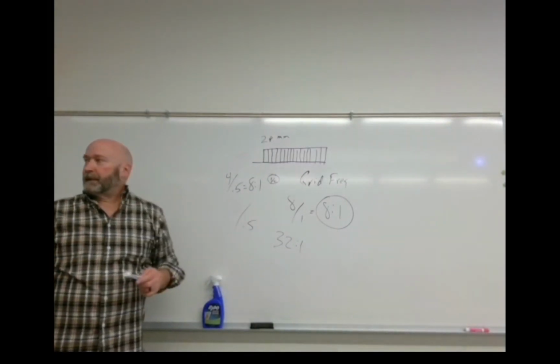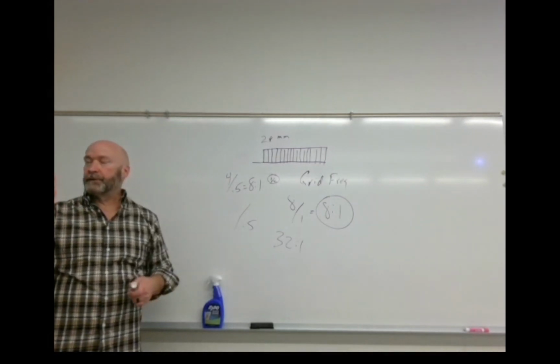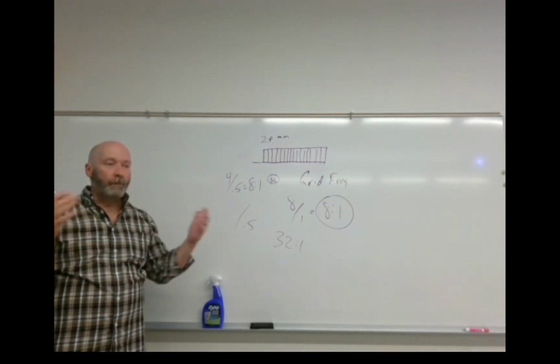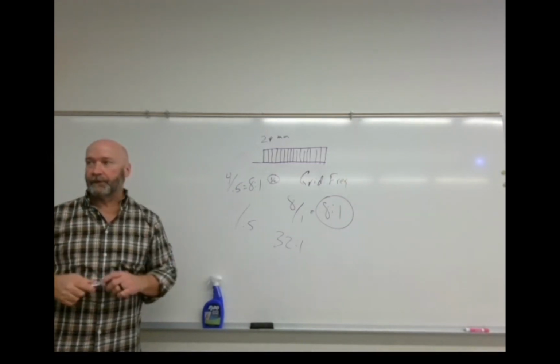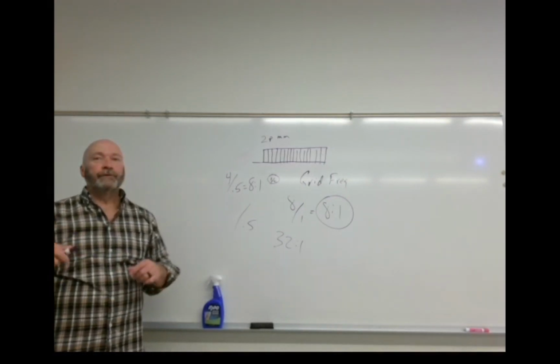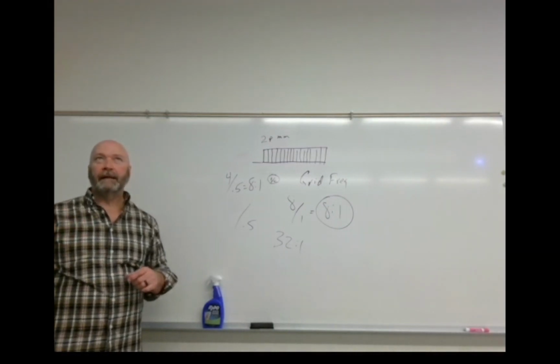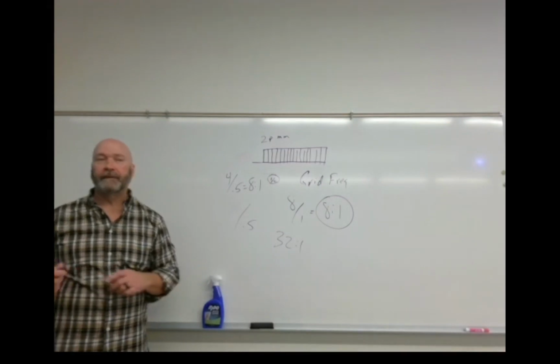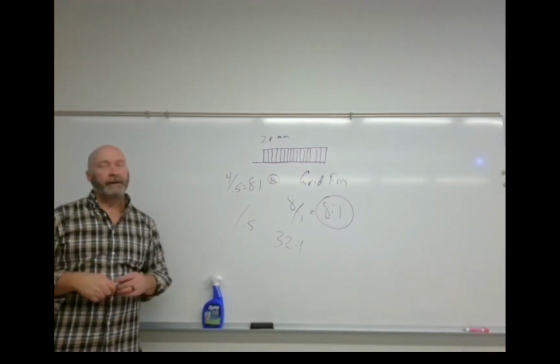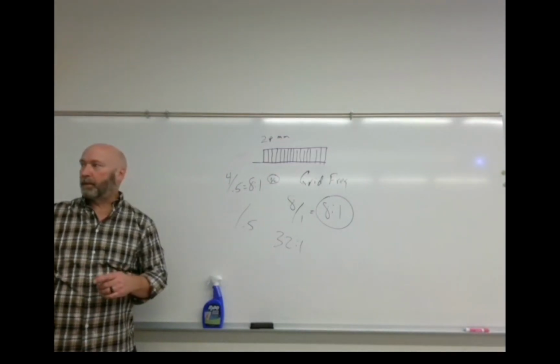Alright, so if you take a picture of your computer screen, and then take a picture of that picture on your phone, what does the picture on your phone look like? You've got lines, right? That's what you refer to as an aliasing artifact, A-L-I-A-S-I-N-G. Aliasing artifact is also referred to as a Moiré artifact, M-O-I-R-É.